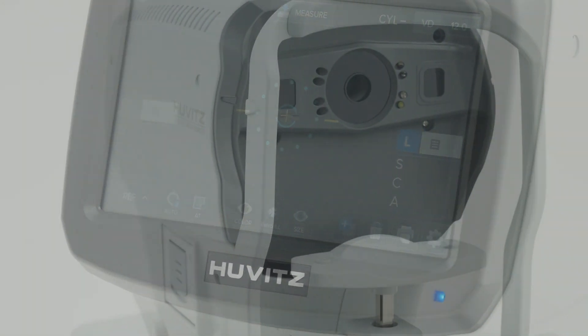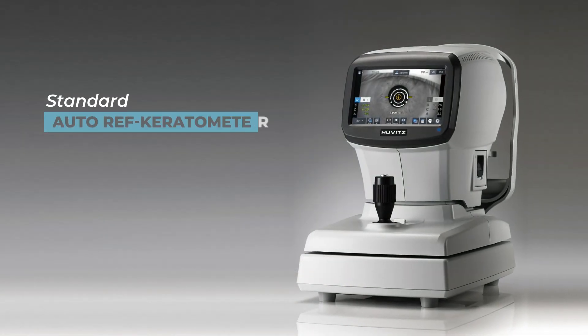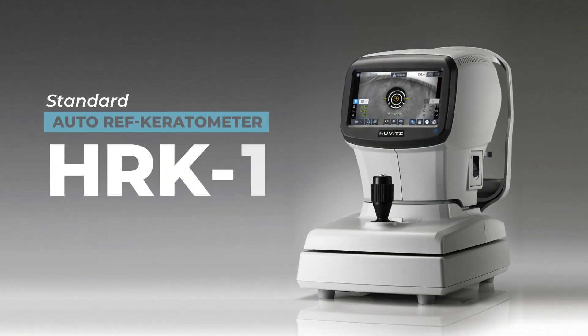Achieve perfect measurement results with the HRK1, standard autorefractometer keratometer.